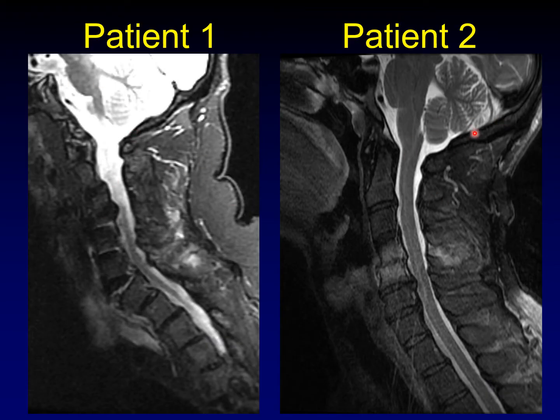Here's patient one and here's patient two. They both arrive with the same clinical history: trauma. This is an MRI for trauma. I encourage you to pause the video right here and look at these two patients and see if you can figure out what the diagnosis is in these two cases.